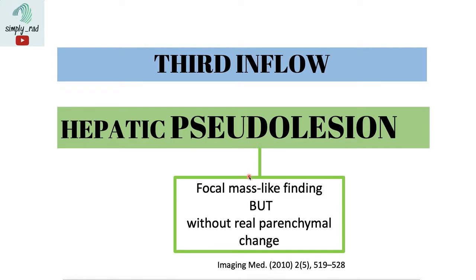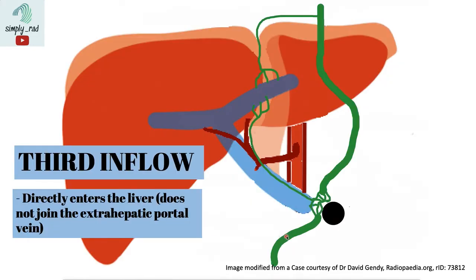Pseudo because it's a focal mass-like finding but without real parenchymal change. Notice here that the vessels drawn in green bypass the extrahepatic portal vein.